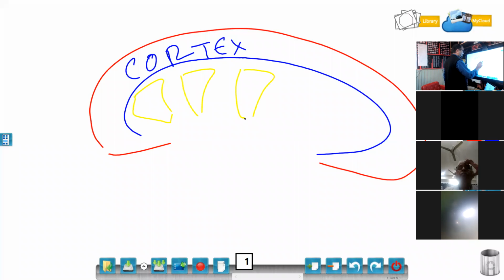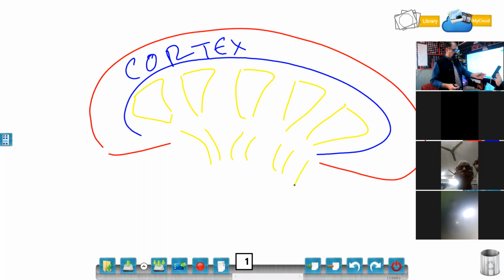I'm giving one small example of how important this anatomy is in ultrasound. Now, what I can see in the comment boxes is: collecting system, collecting system, collecting system. So I got more than 10 right answers. Now implement this on ultrasound. See how: if you see a hyperechoic dot-like structure over here, where I'm drawing right now, that is in the cortex.